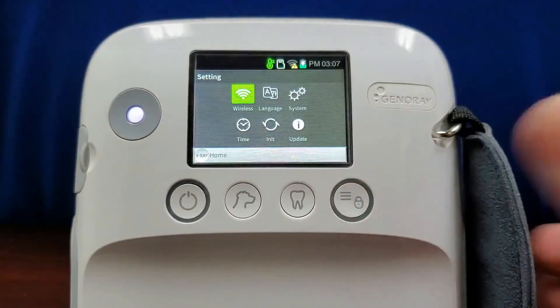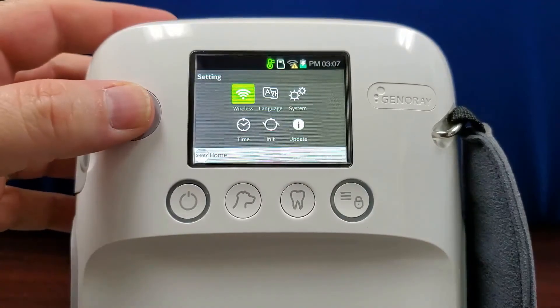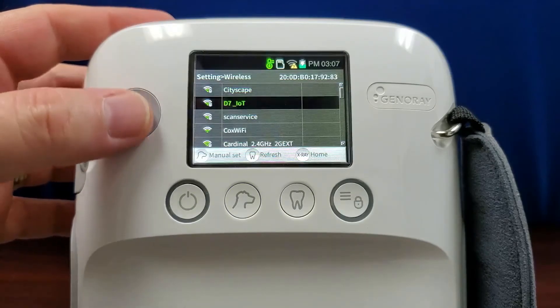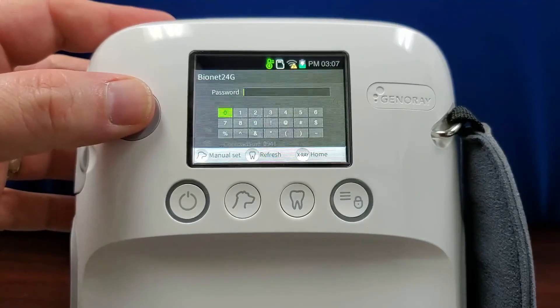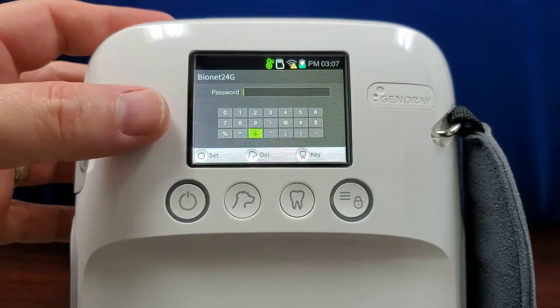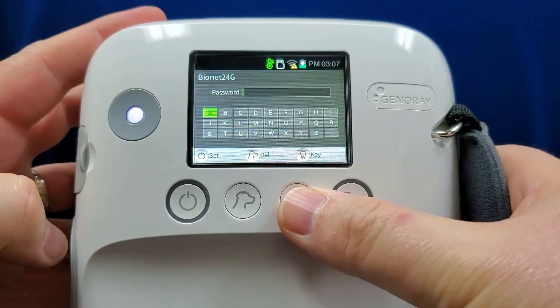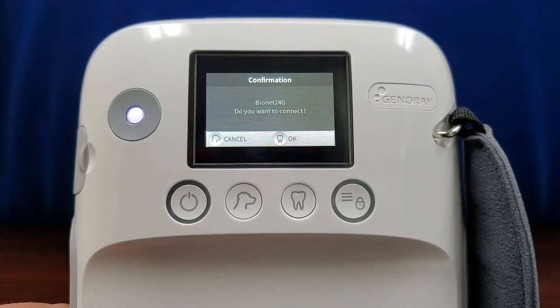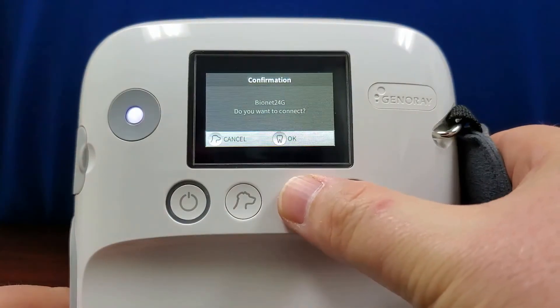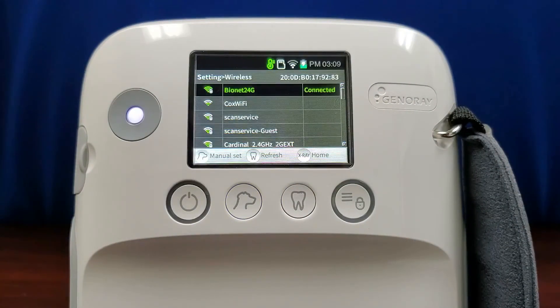Press the menu button to access the unit settings. The first option is the wireless signal. Press in on the trackball and a list of available wireless networks will be displayed. Choose the wireless network you wish to access and input the password by rolling the trackball and pressing in to make a selection. You can cycle through the alphanumeric menus by pressing the position button. Once the password is input, press the power key to continue. A confirmation message will pop up and pressing the position button will confirm the connection. A connected message will appear next to the connected wireless network.